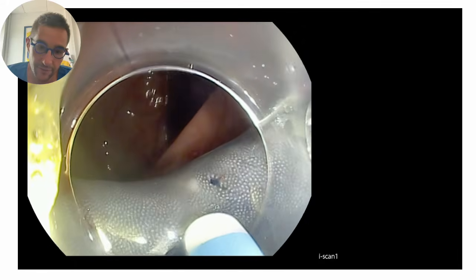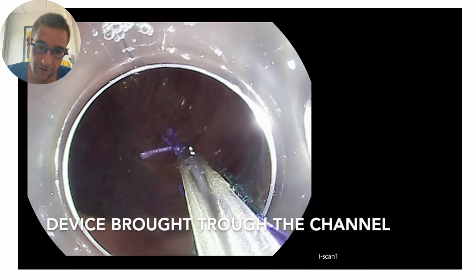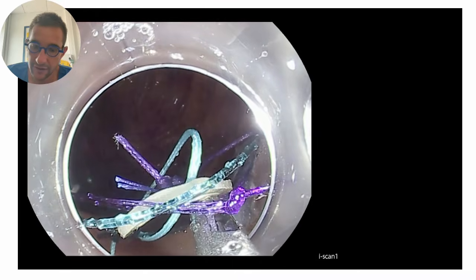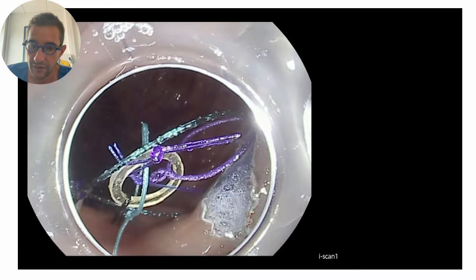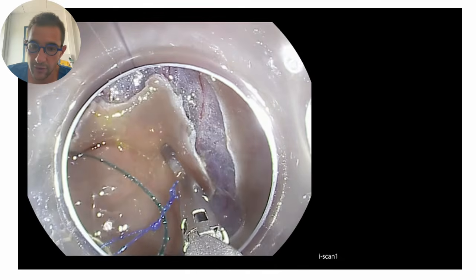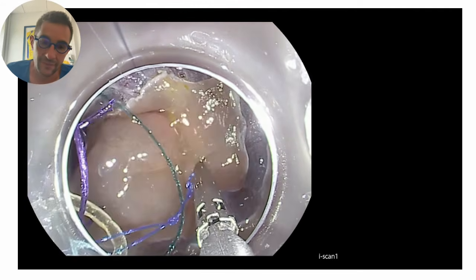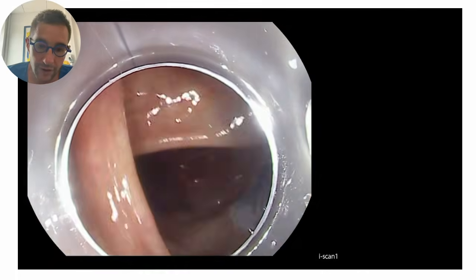So we did the distal incision in retroflexion. We placed the tightening device of traction on all the edges of the lesion. So 4-point multipolar traction.